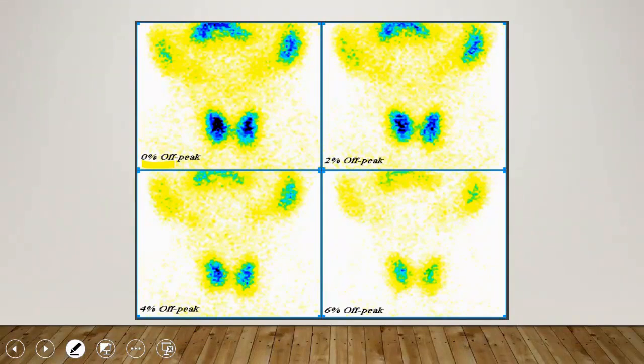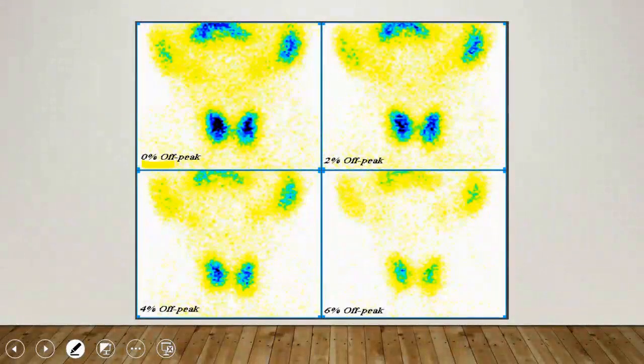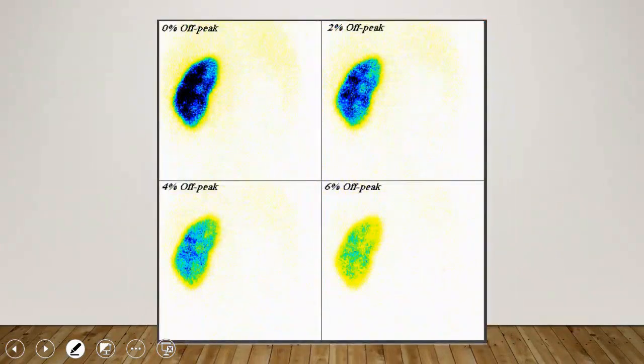The result is that quality control has not been done, or there is an issue with the window you want to set compared to the actual window, and no one is checking this matter. Here is the same idea. This is the kidney. The kidney here is very deep.